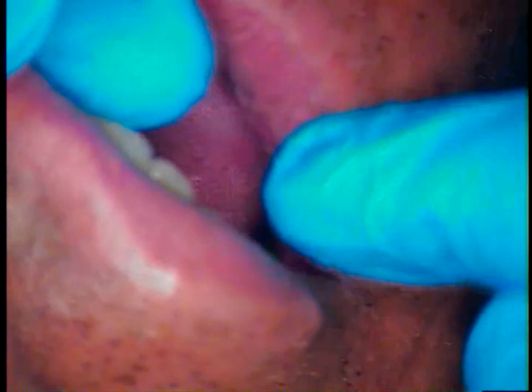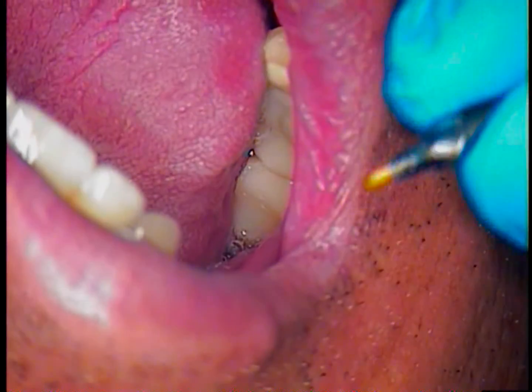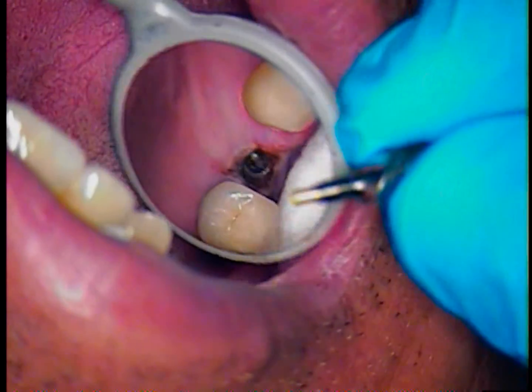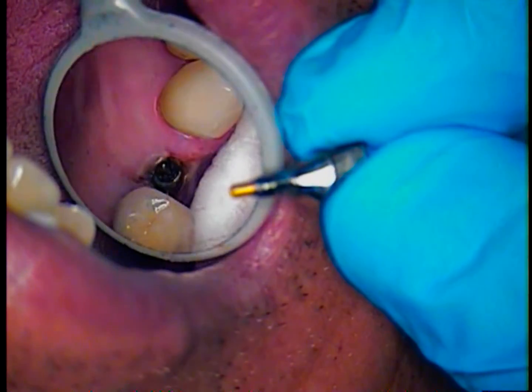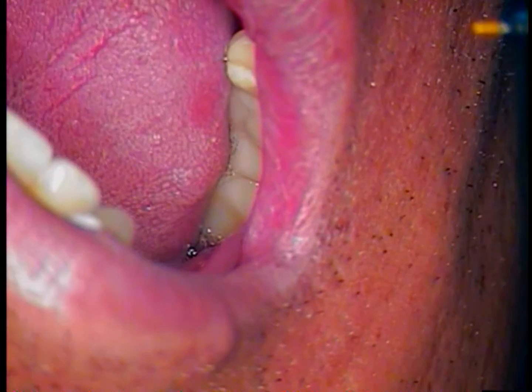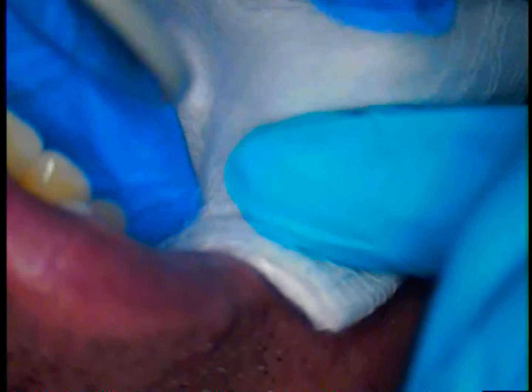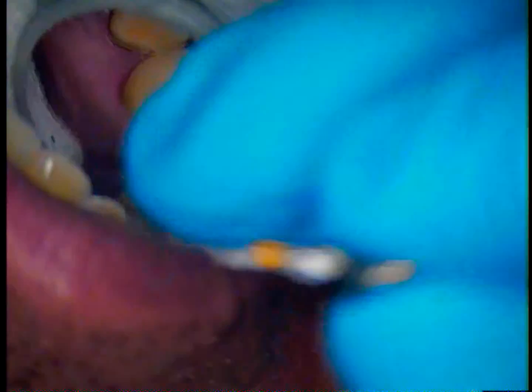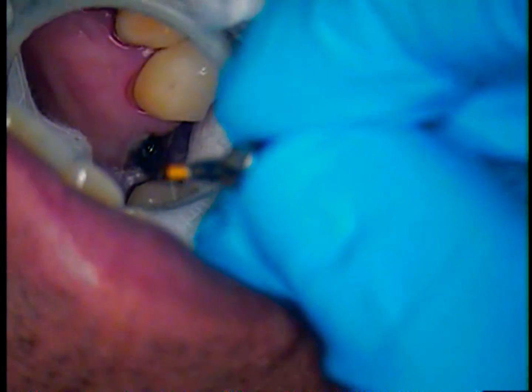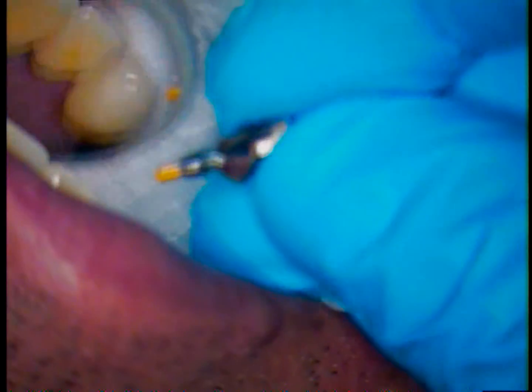The brand new gold-coated titanium screw is inserted. Now I'm going to find the orientation and insert the abutment and the screw together. I have a driver that will fit perfectly in there, and we will eventually be torquing this down to 20 newton centimeters.